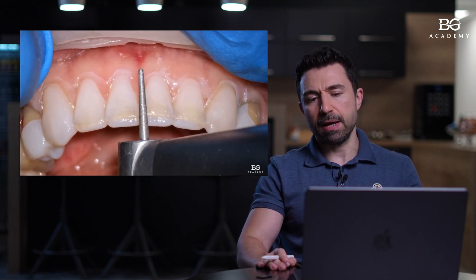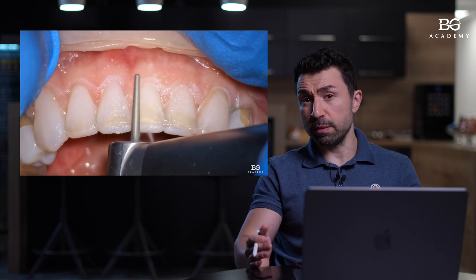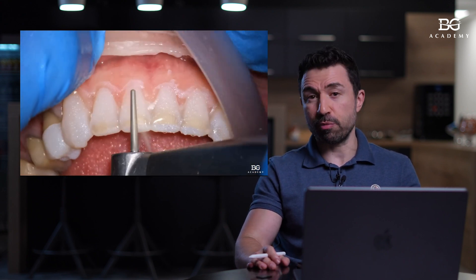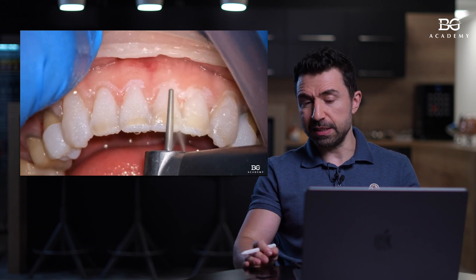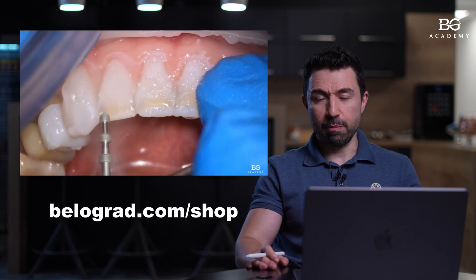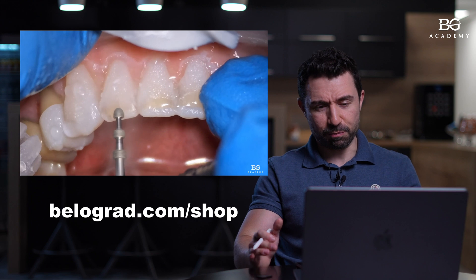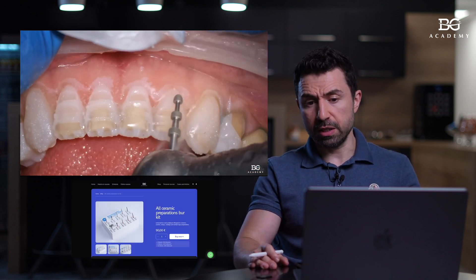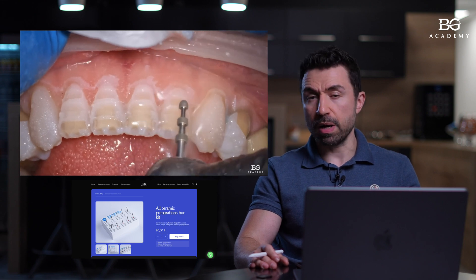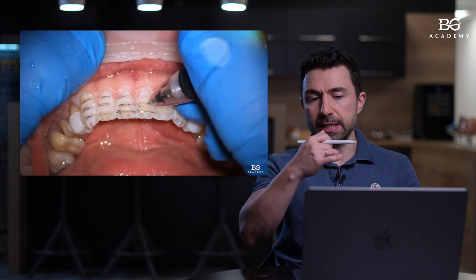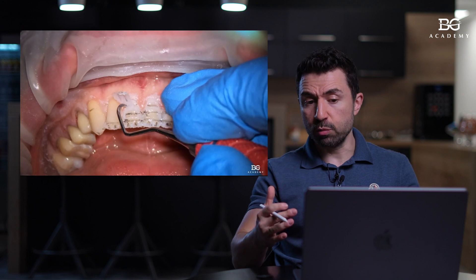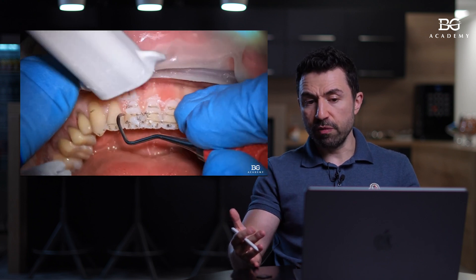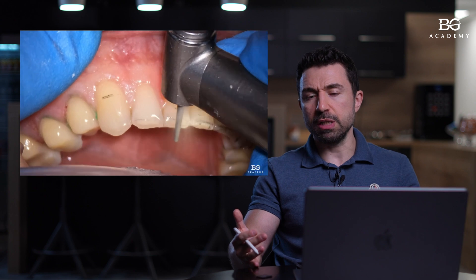Here we have the pre-cut option. You can use any bur you want. In this case, we use our zero 16 bur from the preparation set, which you can find in our online store at belograd.com — we have an online store where you can see our bur block for preparations. Here we did the depth cuts, then we mark everything with a pencil, then we remove the mock-up. After removing the mock-up, we are able to see where we need to cut.